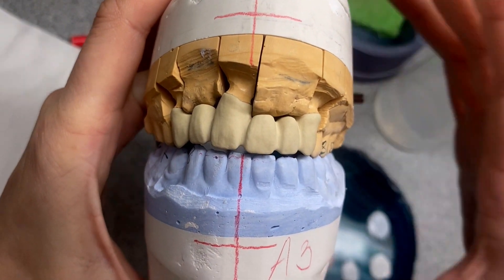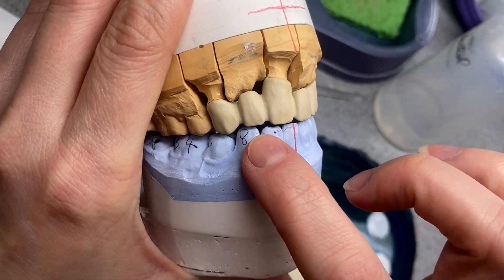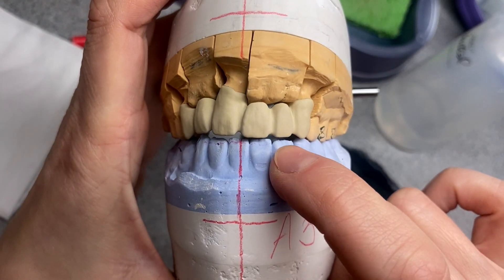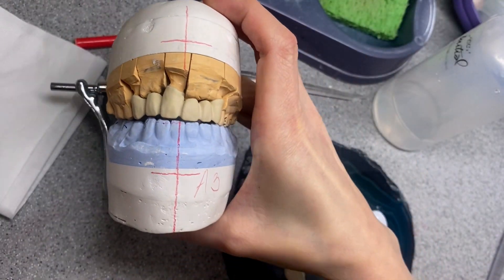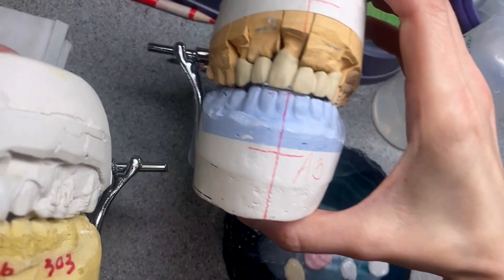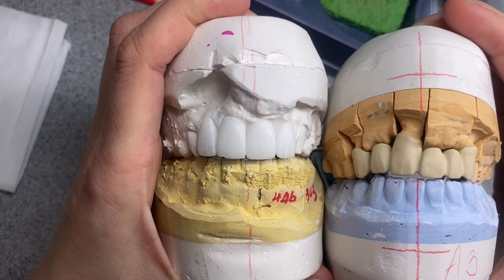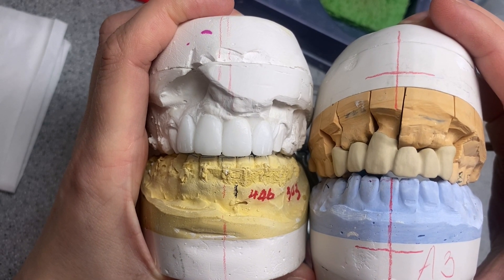Hi guys, how are you today? We have this case — he has a lot of space in here and very little in here, so this is the locked-up bite they did. The teeth are very big. I don't know if I can copy that but I will try, we'll see. All right, let's start.